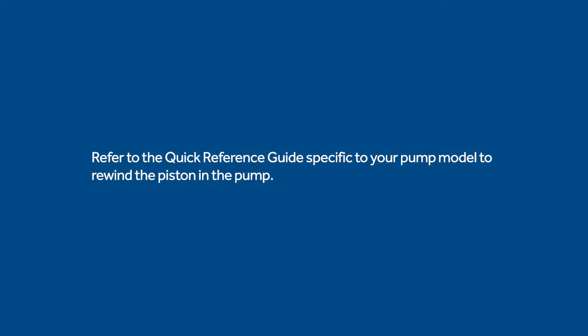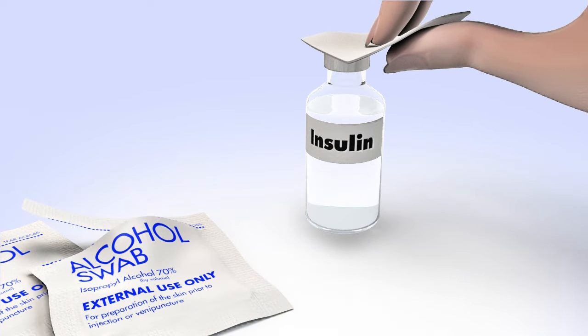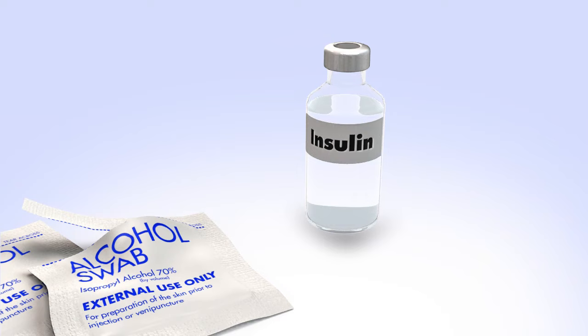Next, you will need to rewind the piston in your pump. Refer to the instructions in the Quick Reference Guide specific to your pump model. To reduce the risk of air bubbles, make sure the insulin vial is at room temperature. Wipe the top of the insulin vial with alcohol and wait until it dries.